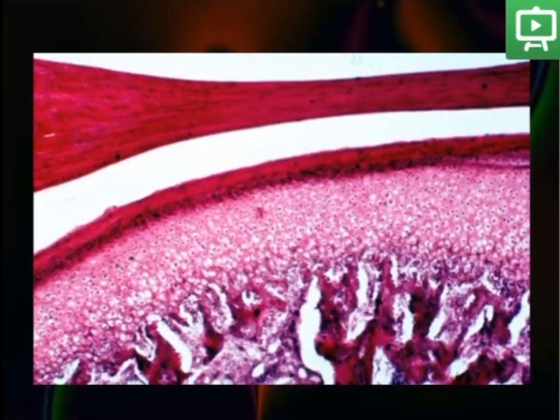Here is also a magnified view of the upper and lower joint spaces divided by the articular disc area. You see it is thinner in the center and thickest at the peripheries. In the center, the fibers are more regular, while at the peripheries it is more irregular distribution of collagen fibers.